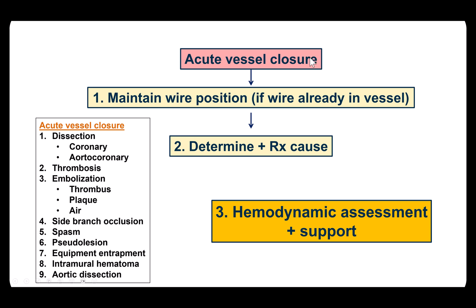So what do we do if we have acute vessel closure? The first step is to maintain wire position, but unfortunately here the wire had been removed, so that is not an option. The next step is to understand the cause. The causes are dissection, thrombosis, embolization, occlusion from a stent or side branch, spasm, pseudo-lesion, equipment entrapment, intramural hematoma, and aortic dissection. In this case, the odds are overwhelmingly that this is due to dissection. When there is such an acute vessel closure, there may be a need for hemodynamic support, especially for a large vessel like the LAD.